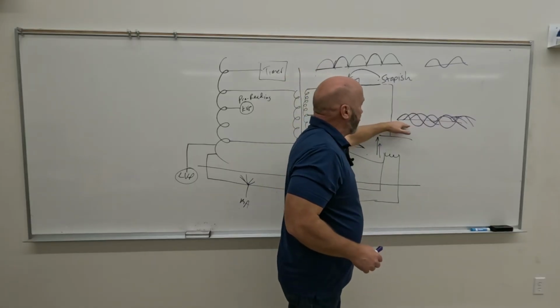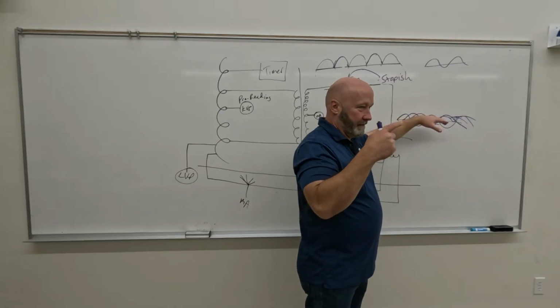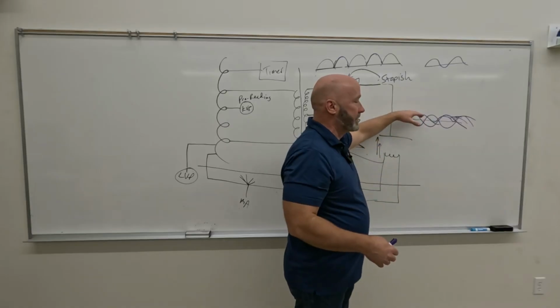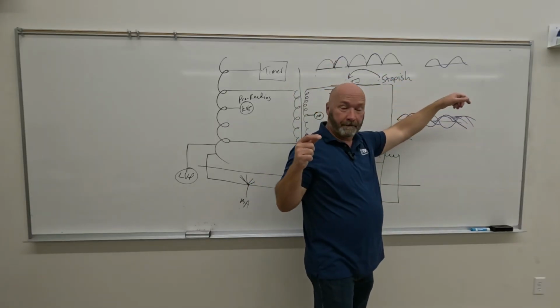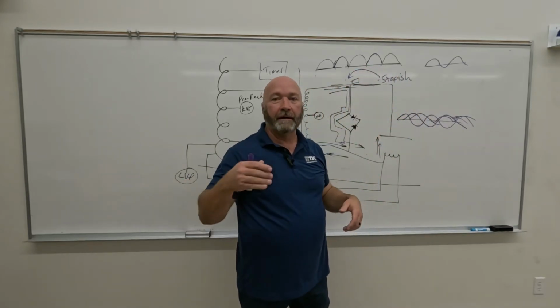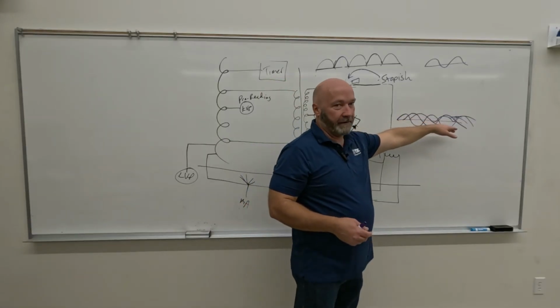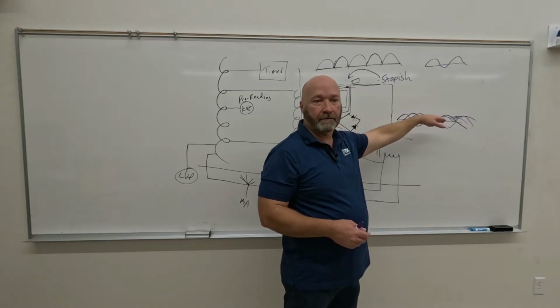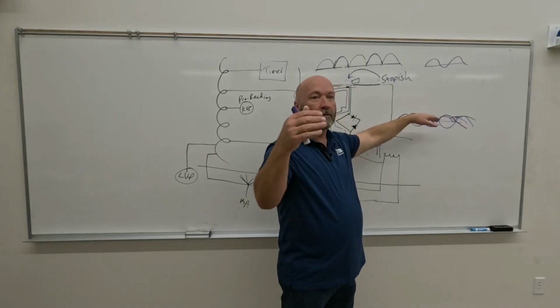The thing with three-phase power is that the voltage waveform, and therefore the eventual power of the X-ray beam once we create X-rays, never drops to 0. Up here on single-phase, full wave and half wave rectified machines, it drops to 0 every time a pulse ends. Okay, so pulses end here, but the power never does. Does that kind of make sense? Each pulse ends, but the overall power never does.